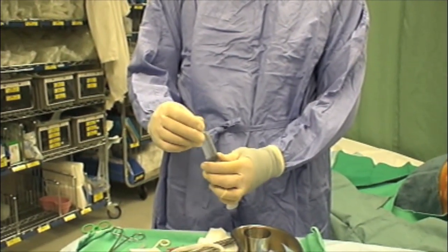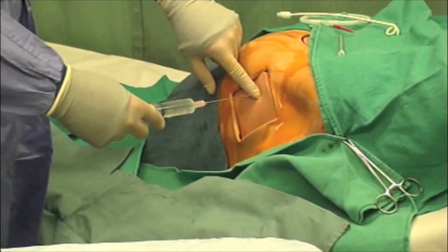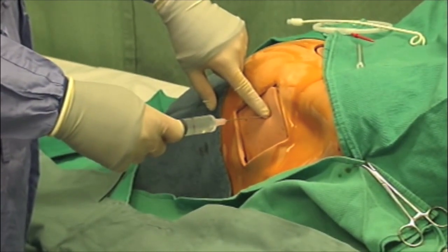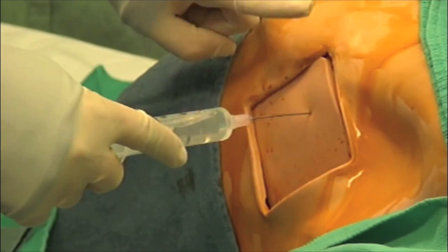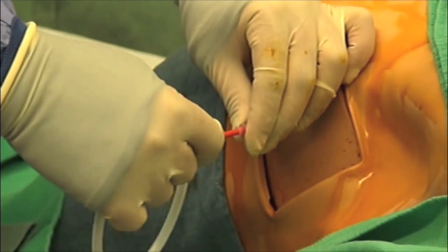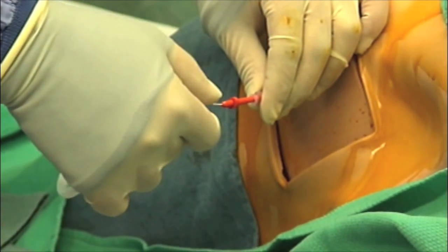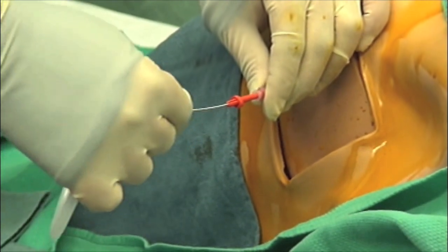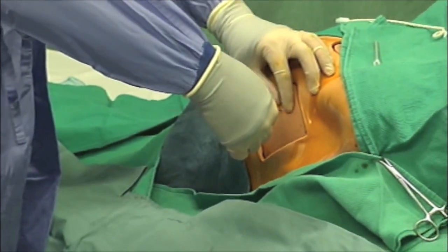Attach the needle to a syringe containing lidocaine or normal saline. Insert the needle toward the pleural space until air is aspirated into the syringe. Holding the needle securely in place, remove the syringe. Insert the guide wire through the needle and into the pleural space. Withdraw the needle, leaving the guide wire in place.